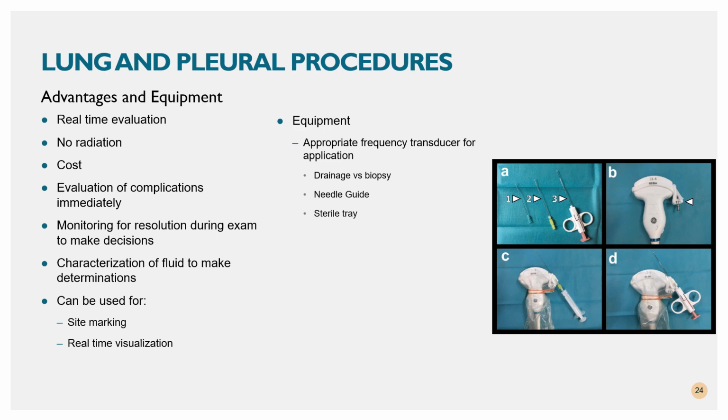Other physicians will want to use real-time visualization, so they want to see the advancement of the needle all the way to, say, a biopsy point. Or they want to watch that needle in real time as they do a diagnostic thora to draw back. So there's multiple ways you can do it. If you're just doing a site marking, usually you don't need any special equipment. If you're going to be trying to visualize the needle maybe on a biopsy the whole time, you might want to utilize something like a needle guide, as you see here.